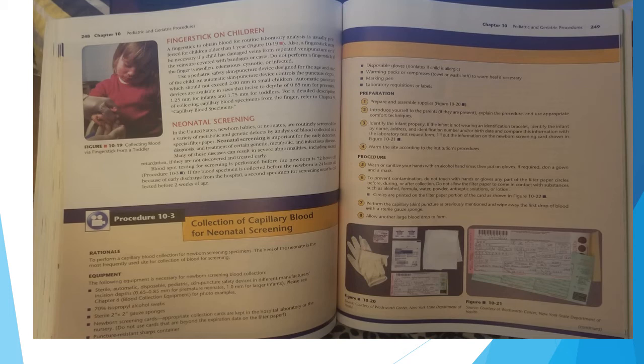70% isopropyl alcohol swabs, sterile 2x2 gauze, newborn screening cards. Appropriate collection cards are kept in the hospital laboratory or in the nursery. Do not use cards that are beyond the expiration date on the filter paper. Puncture-resistant sharps container, disposable gloves, non-latex if the child is allergic, warming packs or compresses to warm the heel if necessary, marker pen, laboratory requisition labels.